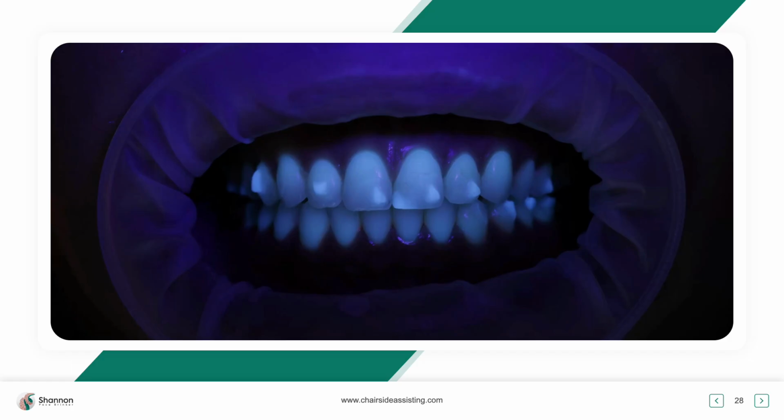Now, I had another dental team member just a week ago say to me, well, who would want something that is fluorescent like this? What if they go somewhere to a club or they go out? And I told her, listen, I'm not trying to be smart, but not one person out of the thousands of attachments that I've placed ever told me they went to a club and their teeth were glowing. Nobody tells me that. For me, it's about the patient. It's about delivering a product that I can see, and most importantly, I know if it's debonded, I know if there's resin behind, and also we can see it.